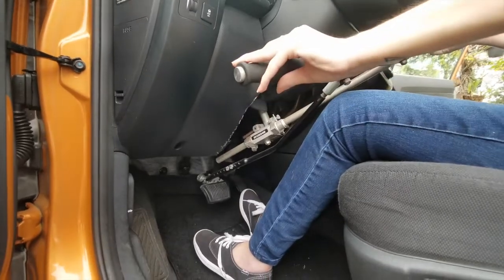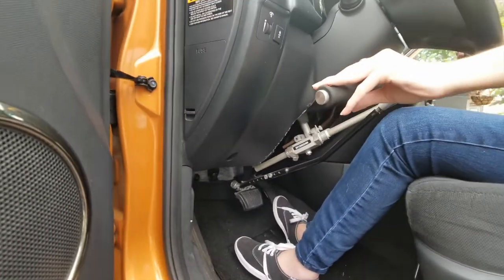The adaptive controls are no longer in an ideal position. The steering wheel is difficult to turn one-handed, which is required for driving with hand controls. And the mirrors are too small. Eventually, I stopped driving completely. But recently, I decided to do what it takes to get back on the road.